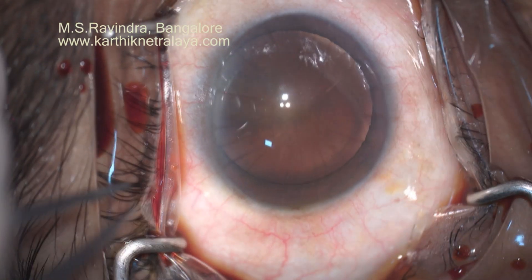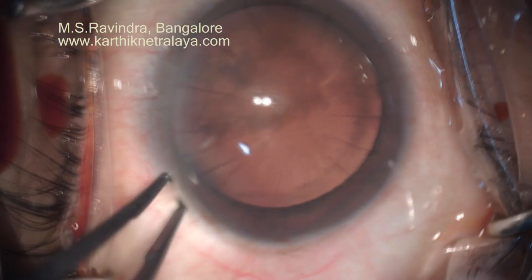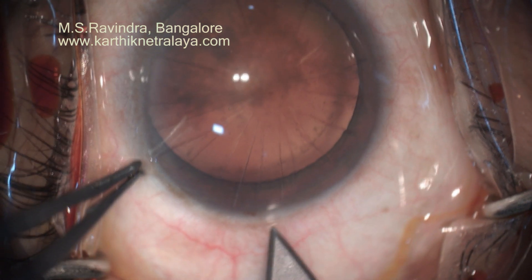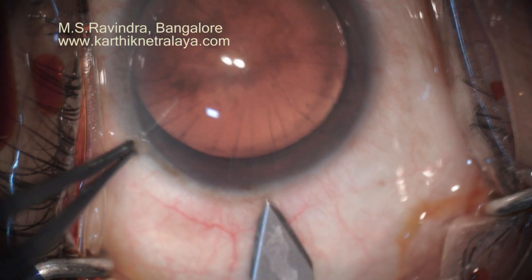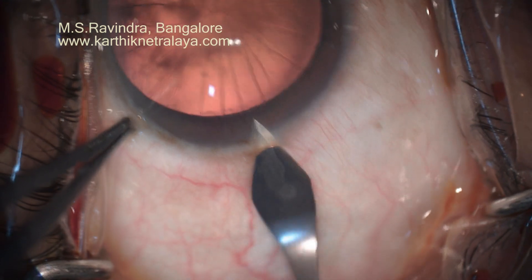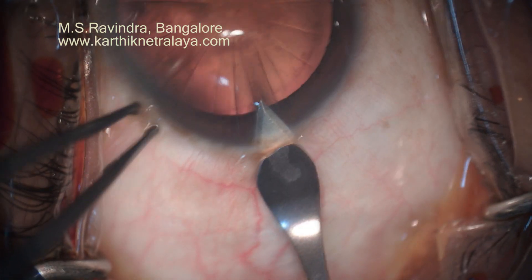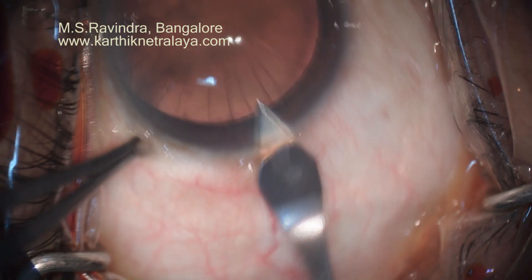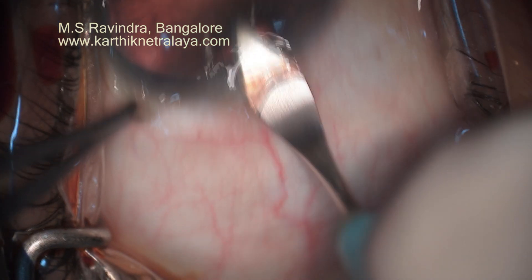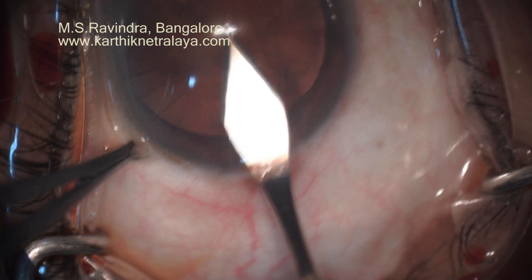Posterior subcapsular cataract in a high myopic eye which had RK done about 14 years ago. You can see more than 24 radial cuts on the cornea. Very careful entry is done into the anterior chamber with the 2.8 millimeter keratome.